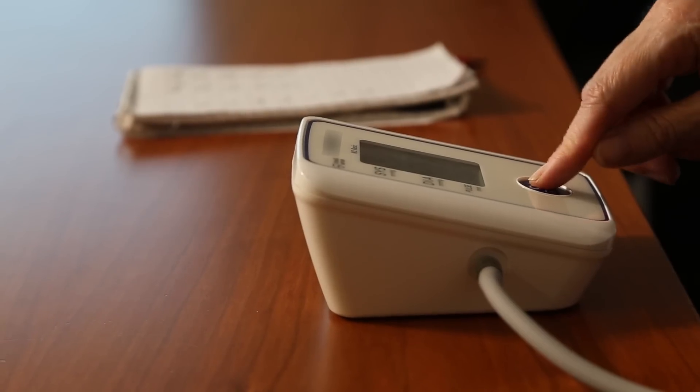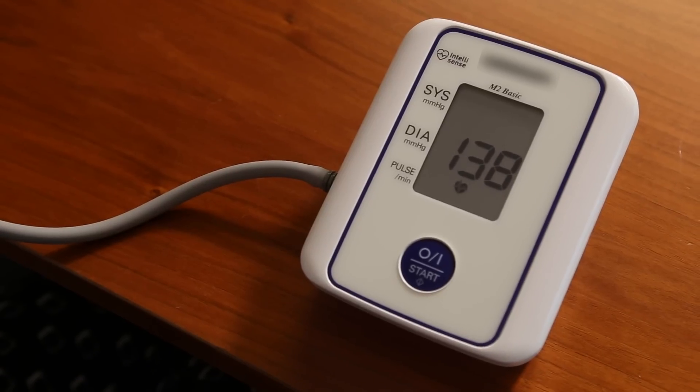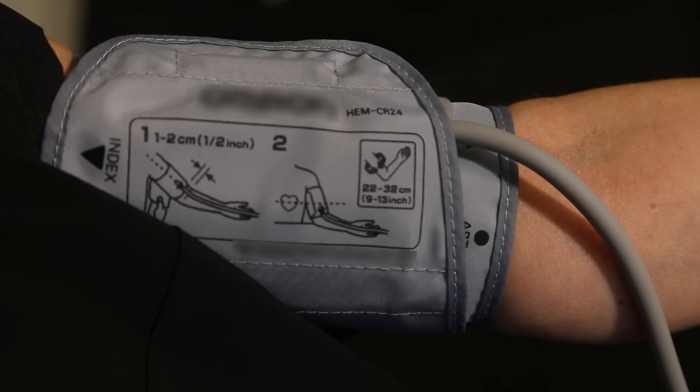Press start on the machine. Sit still and don't talk while the machine is working. You will feel the cuff inflate and deflate.